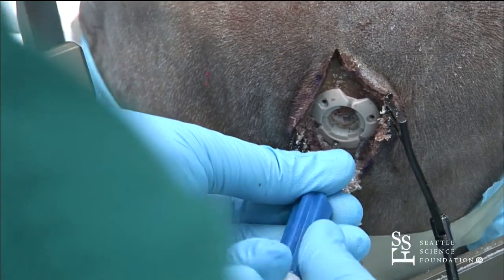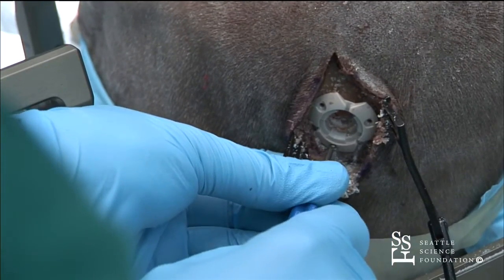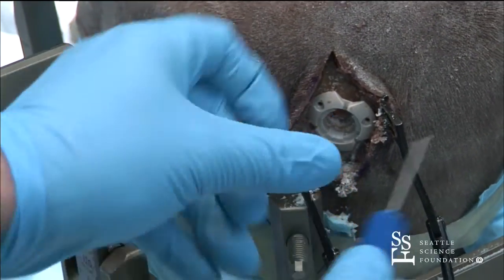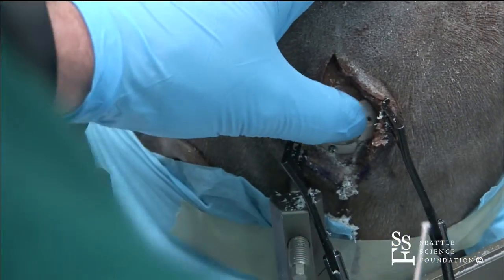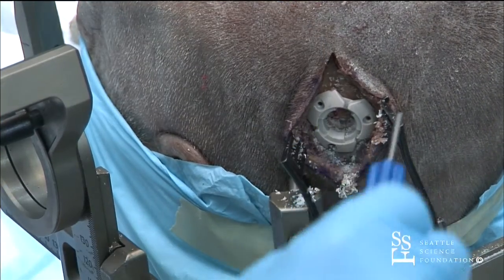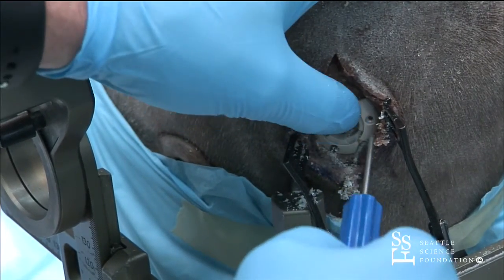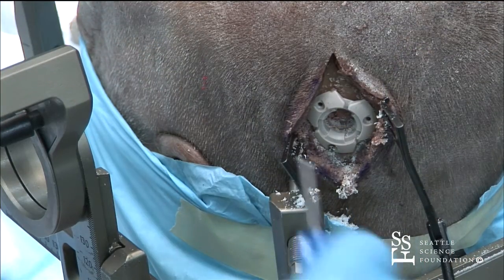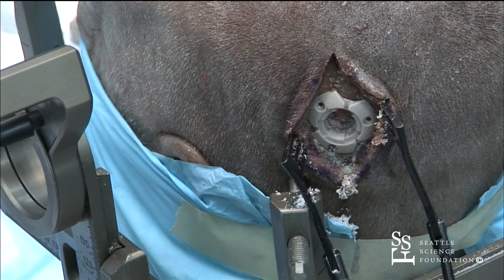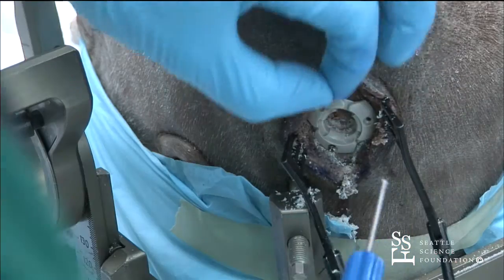And there's a pre-curvature built into the burr hole cover that sits relatively flat on most skulls, but not always. And so it's better when you're putting in the screws for this, if you tighten one down all the way right away, you'll oftentimes have the other side riding up a lot more. So it's better to put them all in halfway at first, and then go around like a tire and tighten them up the rest of the way.